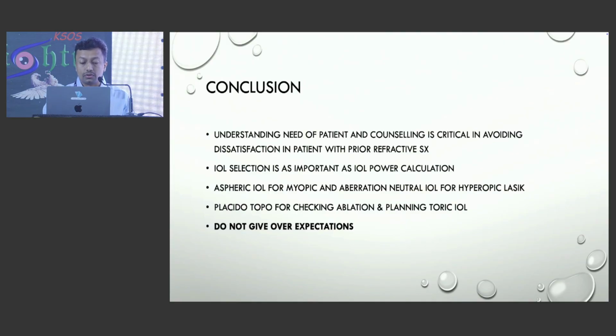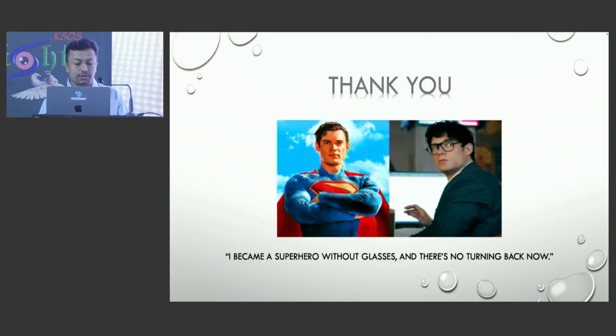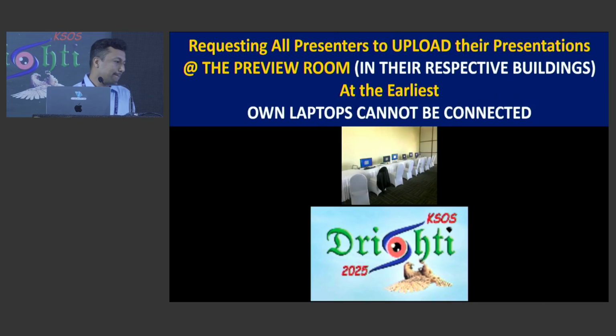And never give over-expectation to the patient of getting a glass-free life after refractive surgery, because minor changes can happen, and preferably it is better not to go for diffractive lenses. The newer generation EDOF lenses are far better, and the monofocal lenses and extended monofocal lenses also do a better job. Thank you.